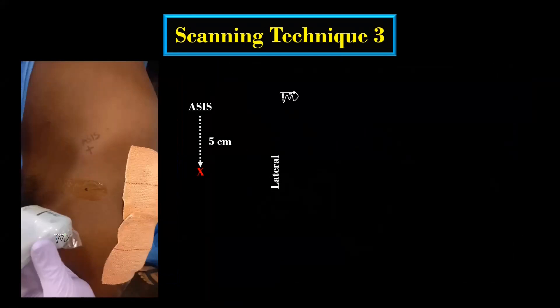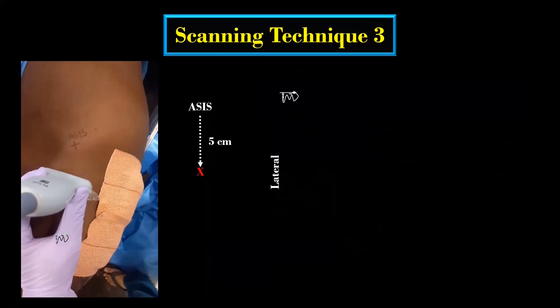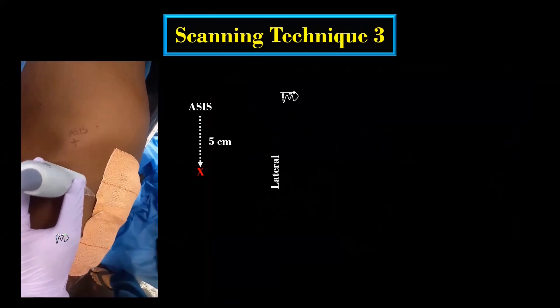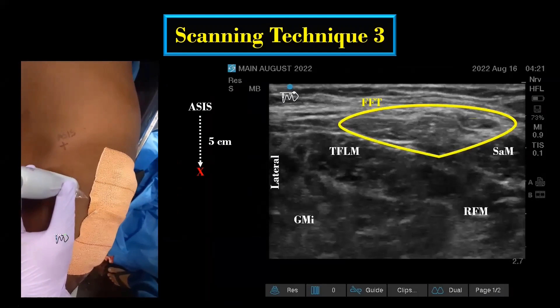In this technique, the transducer is directly placed transversely distal to the anterior superior iliac spine in a straight line within 5 cm from the ASIS. Here, the LFCN can be visualized as a hyperechoic structure in a hypoechoic fat-filled tunnel between the tensor fasciae latae and sartorius muscle.